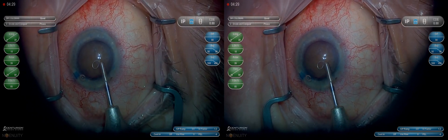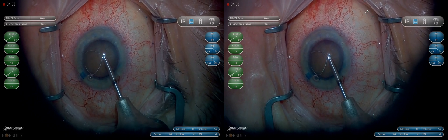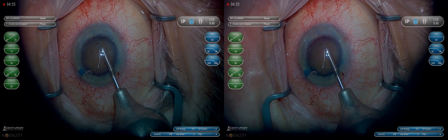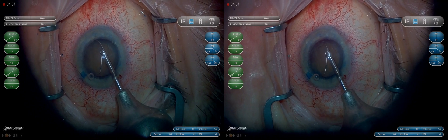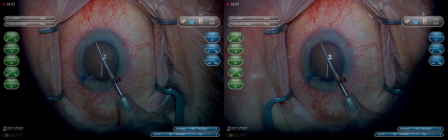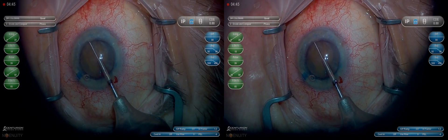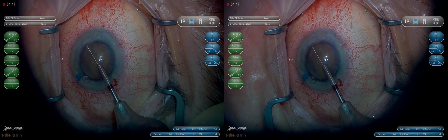I like to place the MyLoop with the loop facing left — it's more natural to me being right-handed. You can see the black mark on the MyLoop, and that's about where you need to place it in the wound to get the correct placement around the lens without shifting the lens and stretching zonules. I rotate slightly beyond where I'd like the wire to be straight down, and then come back.